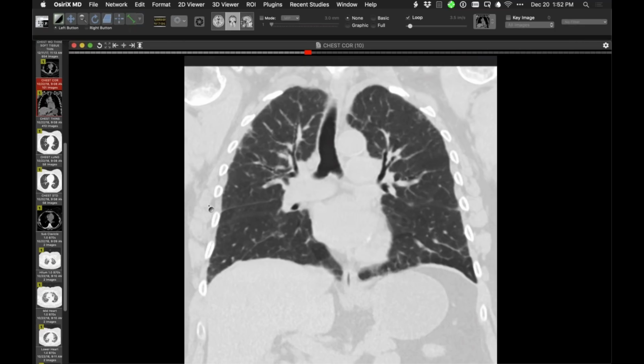So you might want to take another look at that. Just file it away as that's the first time I've seen PCH without actually more dramatic ground glass findings on the CT scan. Very interesting. Okay, I have to go look at that again, because you figure you would need enough abnormalities to actually cause pulmonary hypertension. And they also said that there was no indication of VOD, which often accompanies PCH. So there was not veno-occlusive disease. And they specifically said there was no plexiform arteriopathy. So they really nailed this as a pure PCH. So I was very surprised.